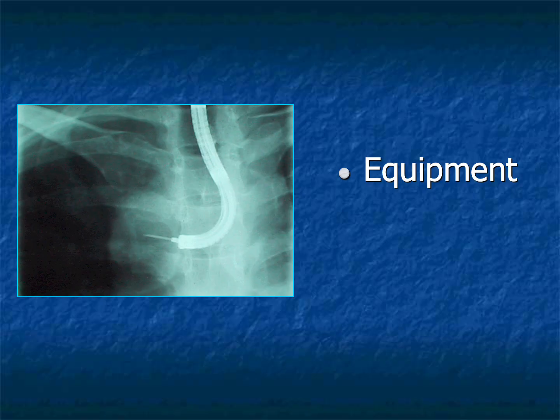Like every bronchoscopic procedure, its success depends upon thoughtful patient selection, careful technique, and an understanding of airway anatomy. Videos specifically related to the technical aspects of this procedure can be found elsewhere on the Bronchoscopy Academy YouTube video site.